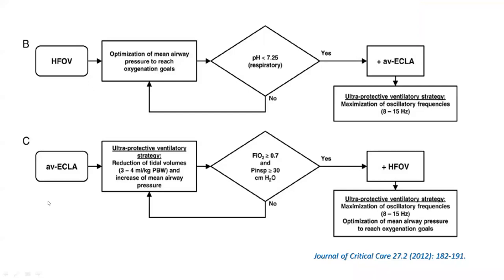If you feel that the patient is failing not because of lung disease or lung conditions, why go to high frequency? Just put him on ECMO and rest the heart and the lungs. That's my impression. We have to differentiate between two things: is it a ventilation or oxygenation issue because of the lungs, or is it because of limited blood flow, because of a shunt lesion, or because of heart failure? We have to differentiate before we select where to go. We know the complications and high risks of ECMO, but if you think there is some room to use high frequency before putting the patient on ECMO, why not try it? But in most cases, we have mainly cardiac issues more than lung disease.